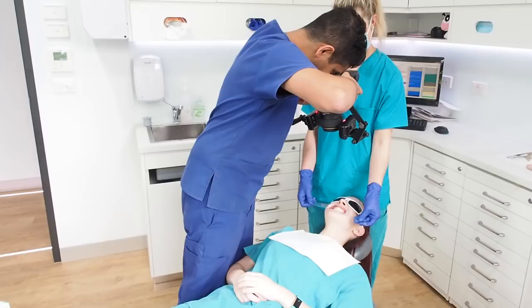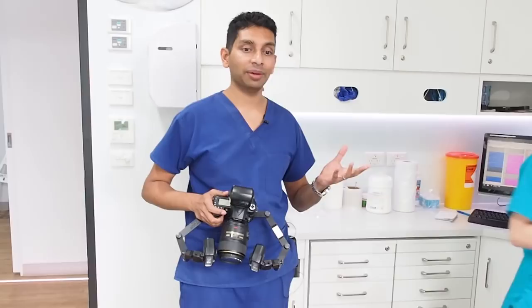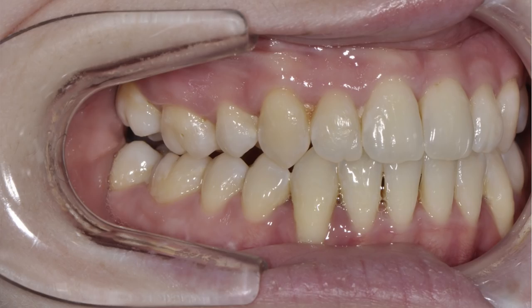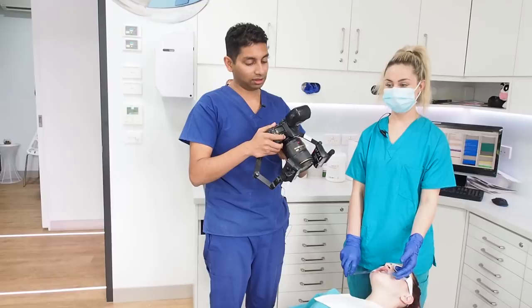The next ones we're going to do are the buccal retraction shots — that's to see where the molar position is, and you want to get as much buccal as you can. If you don't get buccal you get a different relationship to the molars than you think. For instance, if I take one at the wrong angle, it looks like a class two molar relationship. But if I come all the way down with my elbow on my knee, now I can see it's a full class two molar relationship — not just half a class two.